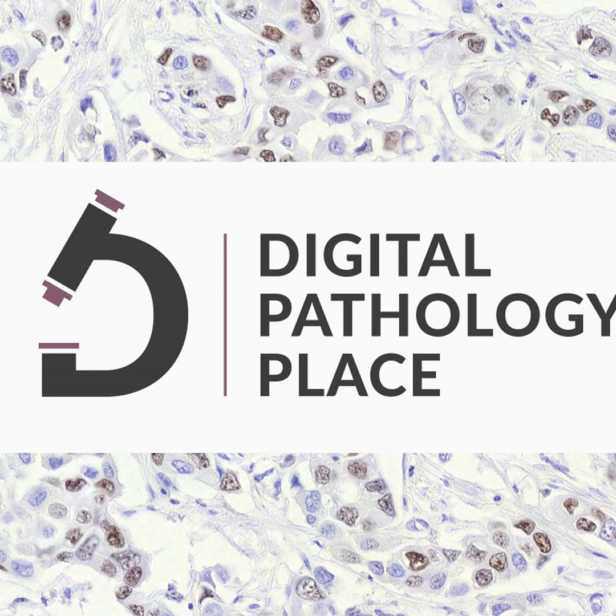Moreover, digital pathology has revolutionized the process of seeking second opinions. Traditional practices of physically sending glass slides for review can be time-consuming and fraught with the risk of damage or loss. However, with digital pathology, images can be securely and instantaneously shared with expert pathologists anywhere in the world. This accessibility can prove invaluable, particularly for complex or rare cases where additional expert insight can significantly enhance diagnostic accuracy, leading to more effective treatment plans and better patient outcomes.